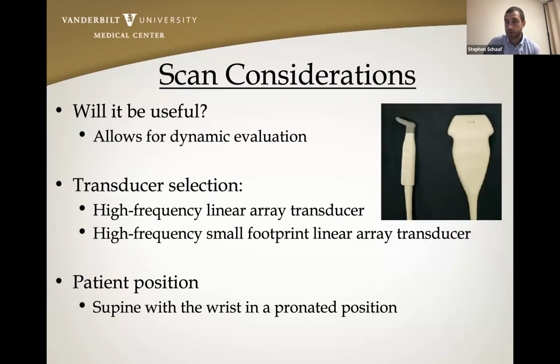So I think for some of these scans, and when you get these referrals, the first question, especially that some of the colleagues will ask, is: is ultrasound going to be useful in this scenario? And I definitely think for a case like this, especially where you're having dorsal wrist pain plus popping, that it potentially is more of a dynamic issue, then ultrasound is really going to be ideal in these scenarios to evaluate for any type of instability, especially.